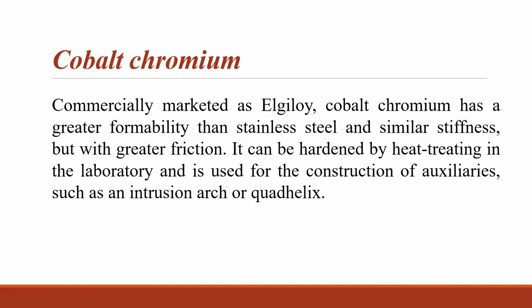Cobalt chromium, commercially marketed as Elgiloy. Cobalt chromium has a greater formability than stainless steel and similar stiffness but with greater friction. It can be hardened by heat treating in the laboratory and is used for the construction of auxiliaries such as intrusion arches or quad helix.